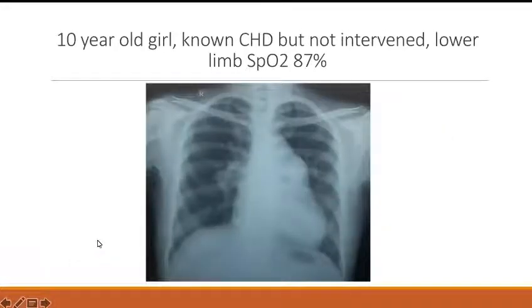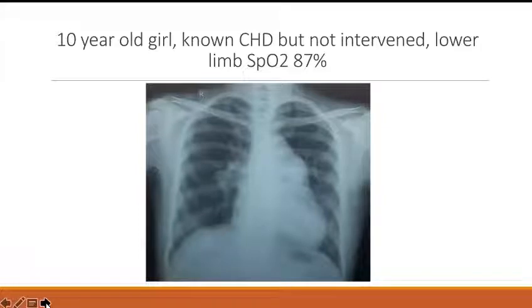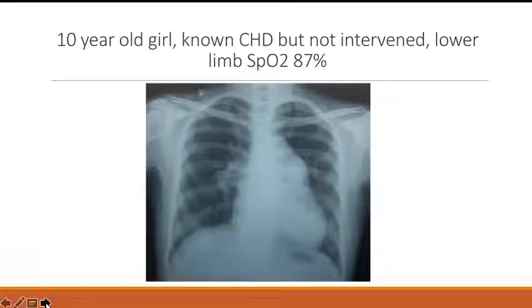So this is the Eisenmenger X-ray and that is TOF with absent pulmonary valve. In Eisenmenger syndrome due to ASD, VSD, or PDA — is there any difference in the X-rays? Can you find out that this is Eisenmenger ASD versus Eisenmenger VSD or PDA?